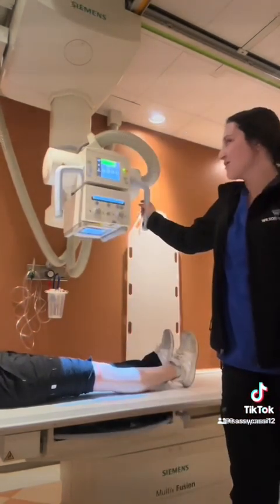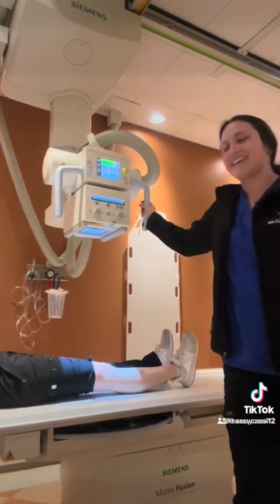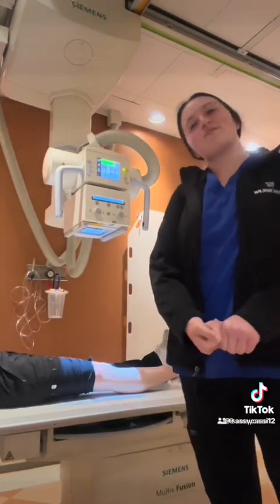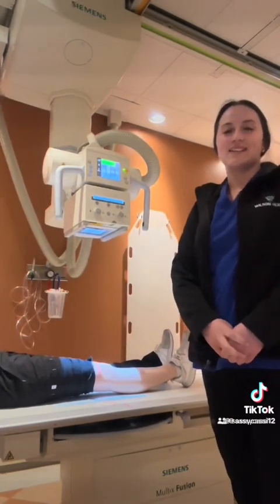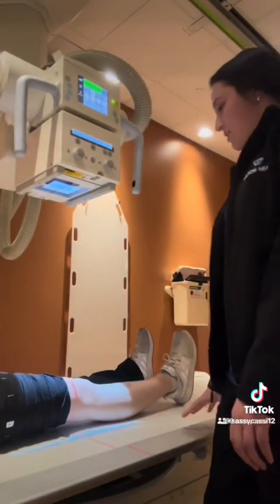There'll be no angle in the tube because her ASIS is in between 19 and 24 centimeters. If she was thicker than 24 centimeters, then I would have to angle the tube cephalic. And if she was less than 19 centimeters, I would have to angle the tube caudal. I'm going to put Shelby in the right position lined up with the central ray.